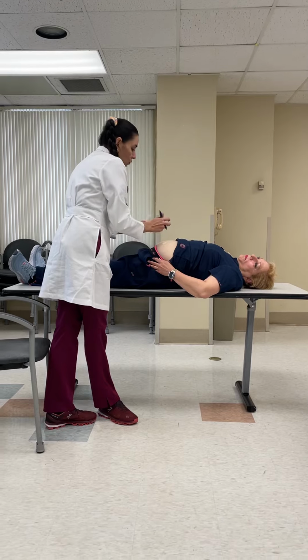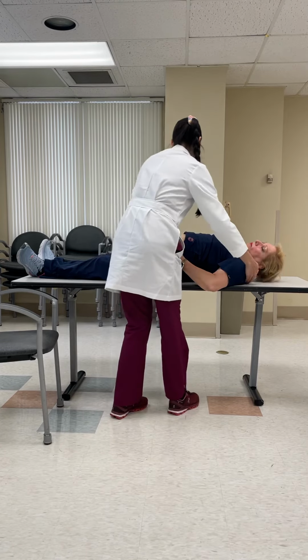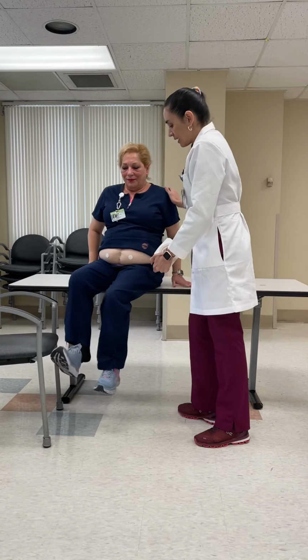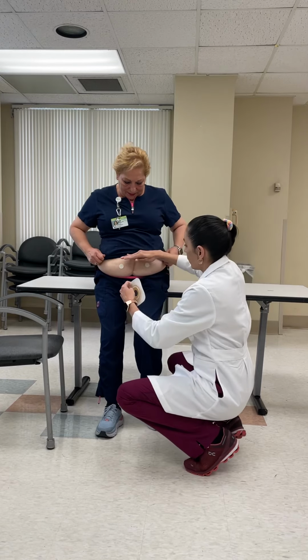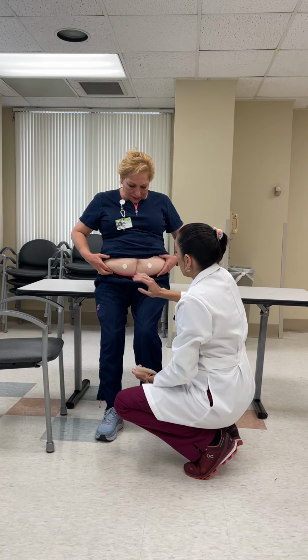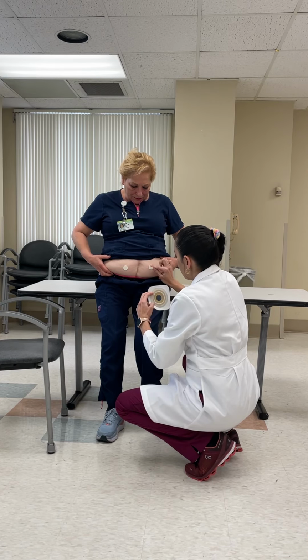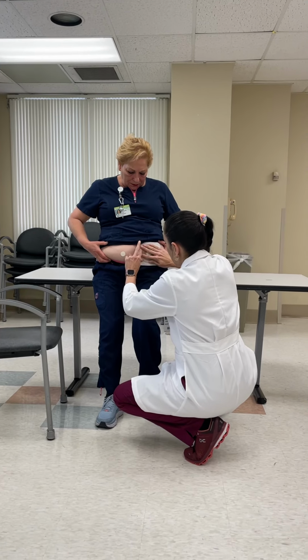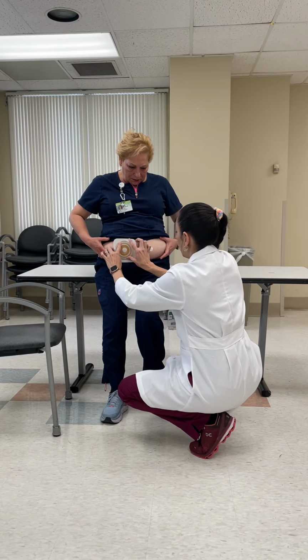Now what we have to do is make sure that the patient in other positions also has the right fit. So come over with me, please. Sit down. This time we're having the patient sit down, and we're going to locate the area. In her case, she had the fold here, but we are located in the rectus muscle below the belt line, and we have this one tentative, and when we check it, you see it does not correlate. That looks good in case it would be either one.